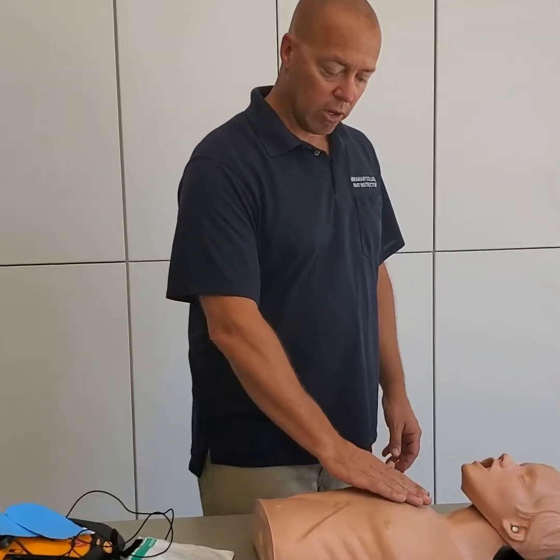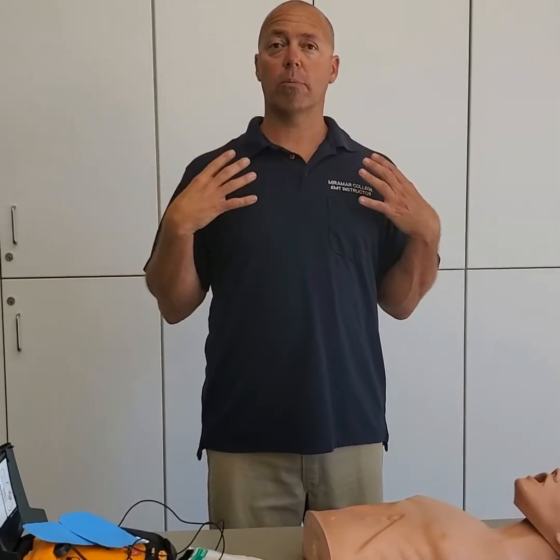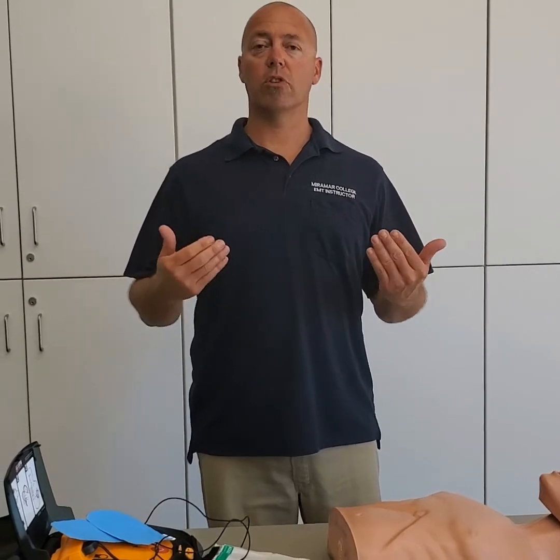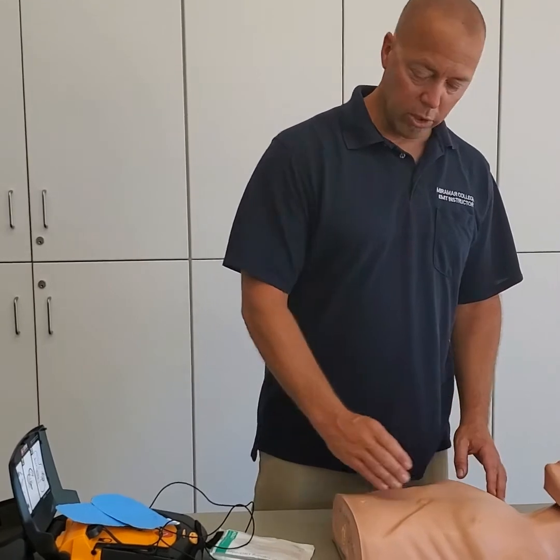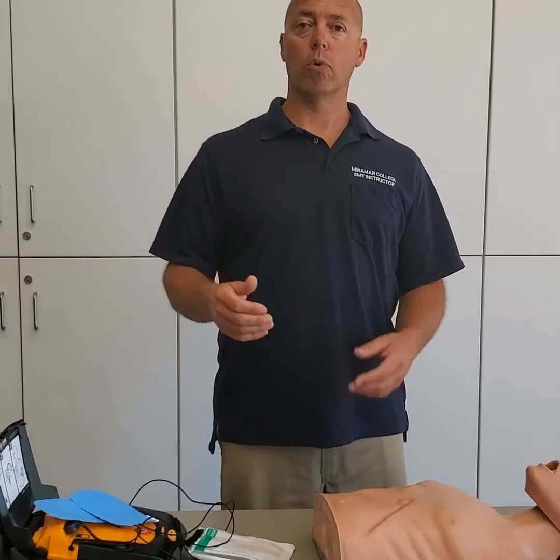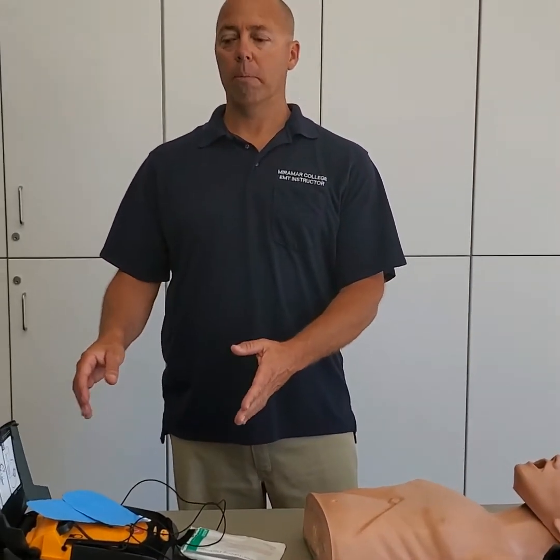The other thing to consider is that we have to have good pad contact on the chest. If you have a patient with a lot of hair, a hairy chest, the pads generally are not going to contact the skin very well, which means it's not really going to work. Most of these AEDs come with a little toolkit that will include a razor. We'd take out the razor, scrape off the hair on the chest, and then apply the pads.